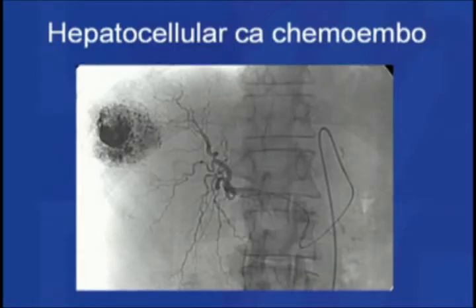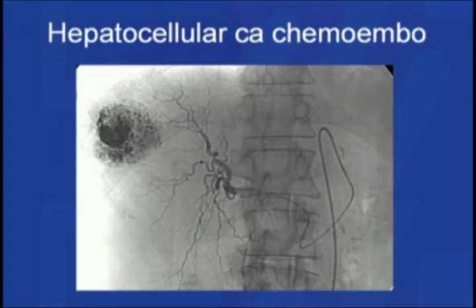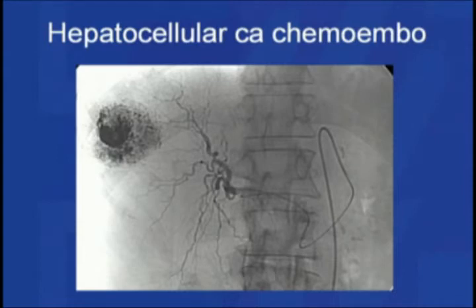Side effects like diarrhea, neuropathy, skin changes, and heart toxicity are therefore less than if it was given in the venous form. I'll show you one image just before we roll the video — an arteriogram image from a chemoembolization of this type of tumor, but not in this particular patient. It illustrates nicely how this material deposits very focally in the lesion and not to the same degree in the background liver, which in this case was a background of cirrhosis. If we could roll the video clip now, we'll watch some footage from this procedure.